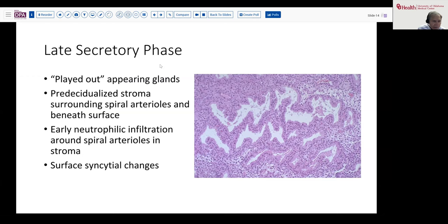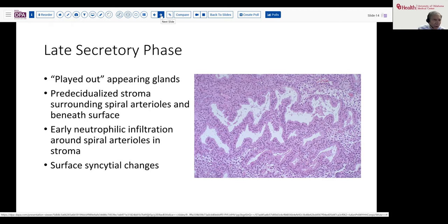In the late secretory phase, these glands continue to have a sort of played-out appearance — they've spent their energy to produce the secretion and the cells become smaller. The pre-decidualized stroma appears around the spiral arterioles. You may begin to see even early neutrophilic infiltration around these arterioles or in the subsurface. Occasionally you'll begin to see surface syncytial changes. As the stroma begins to collapse, the surface lining cells seem to shrink around it or become syncytial knots of cells associated with the tissue.